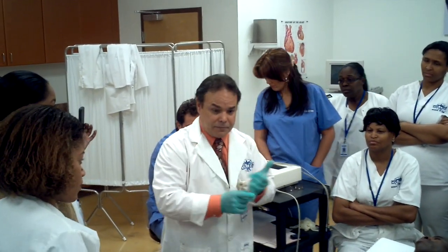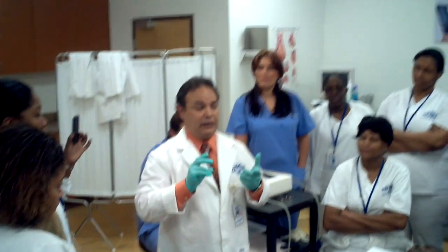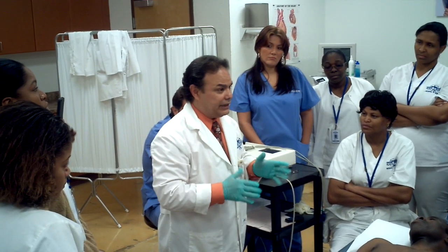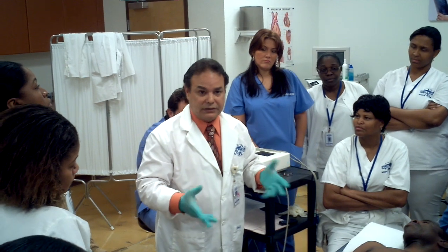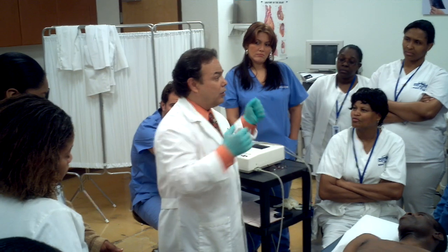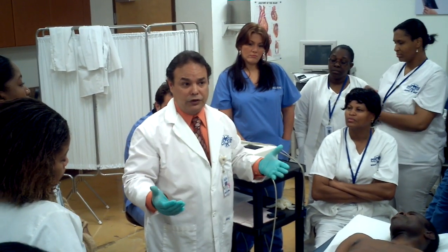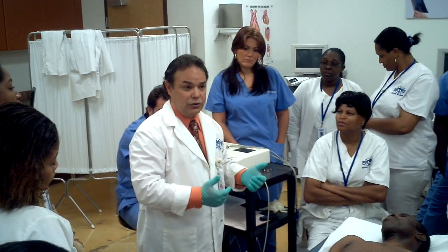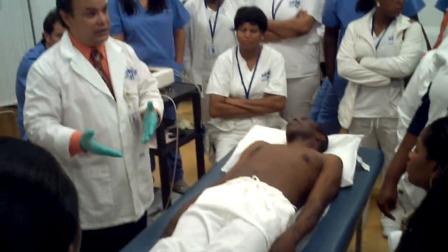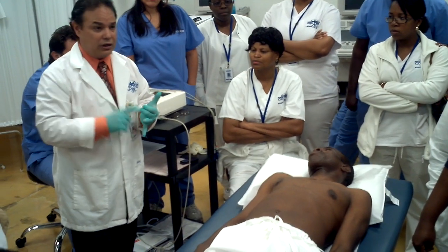They can detect infarctions, they can detect ischemia, they can detect hypertrophy, and they can detect conduction abnormalities like heart blocks and other things you should learn. I recommend all nurses and all students to really get familiar with the rhythms, because most of you are going to work in the ICU, the CCU — cardiac care unit — areas where you'll be in contact with the EKG. At least the biggest arrhythmias you need to know, like ventricular fibrillation and ventricular tachycardia.